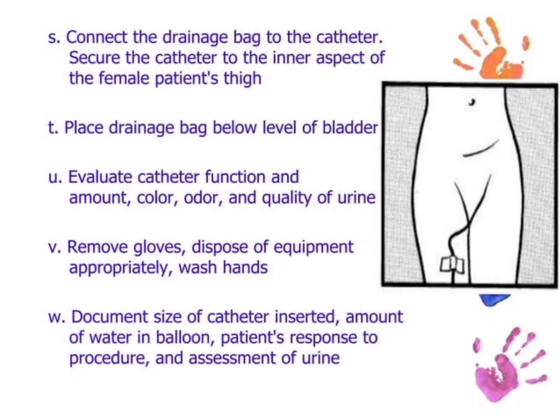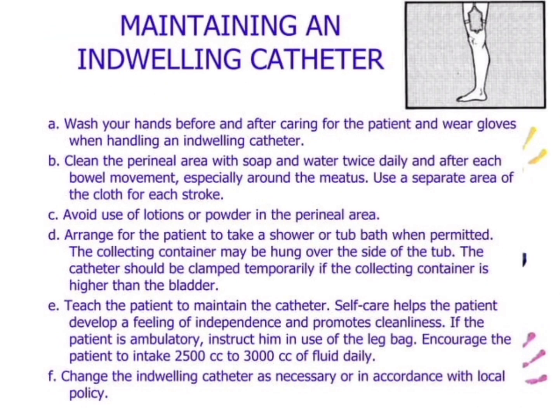Remove gloves and dispose of equipment appropriately. Wash hands. Document the size of the catheter inserted, the amount of water in the balloon, the patient's response to the procedure, and assessment of urine. Maintaining an indwelling catheter.